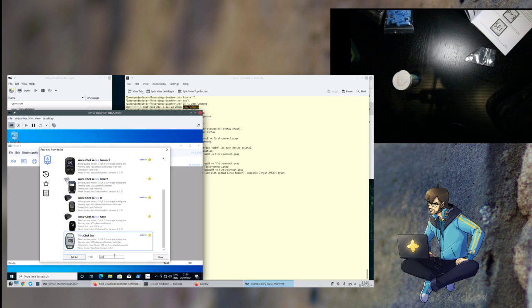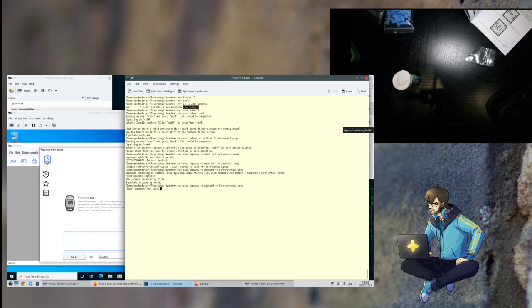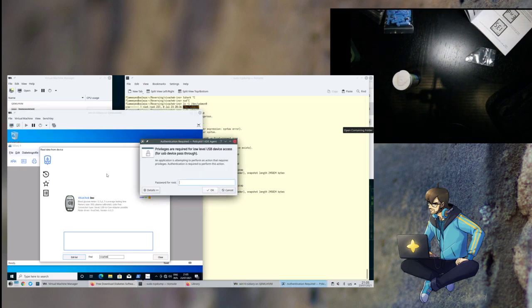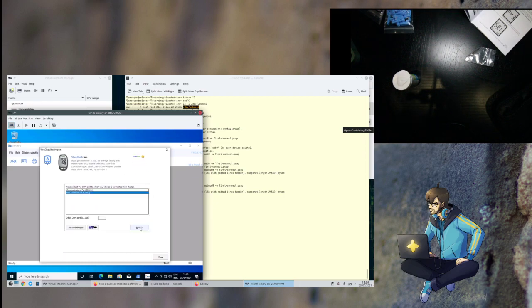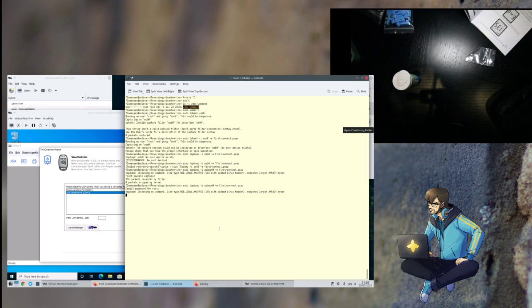This is the VivaChek. You know, yes. USB mon is still listening. I'm going to terminate it and restart it because there is nothing. Okay. Device pass through. Yeah, it's code free. Go on. Import everything. Could not read any data. But it's possibly because there is no data in it. Going to terminate this for a moment. It read something, or at least it sends something.